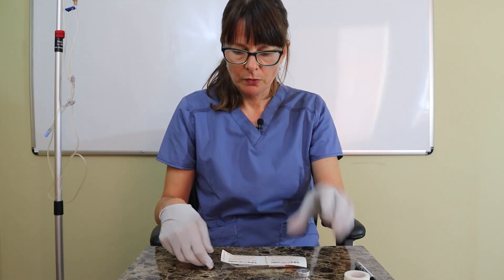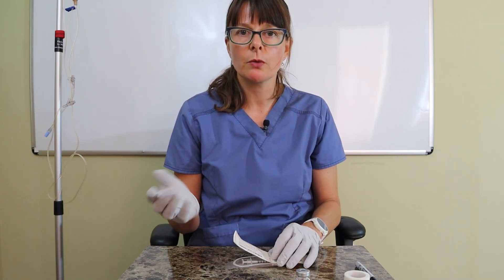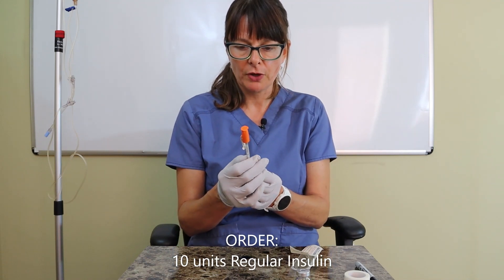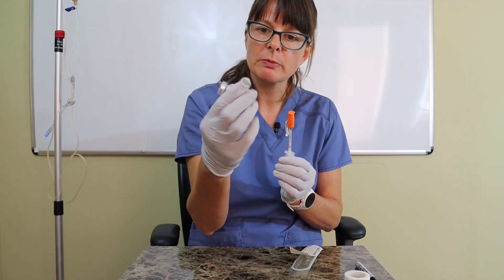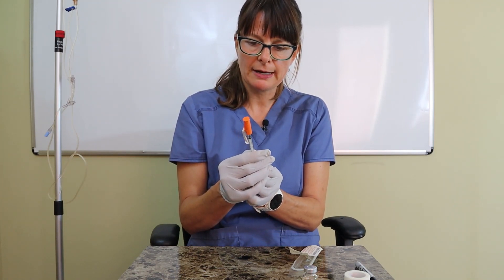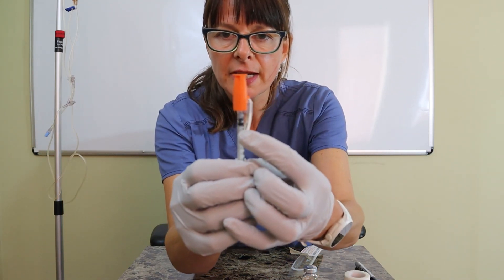As with any medication vial, we always want to inject the amount of air first equal to what we're going to withdraw. In this case I'm going to draw up 10 units of regular insulin. Always make sure to check the vial for the expiration date and that you have the right medication. I'm going to pull the plunger back to the 10-unit mark.